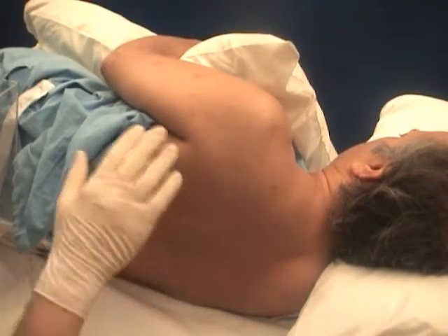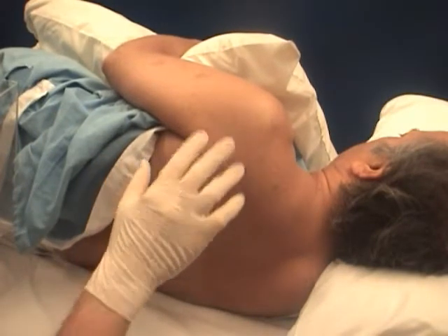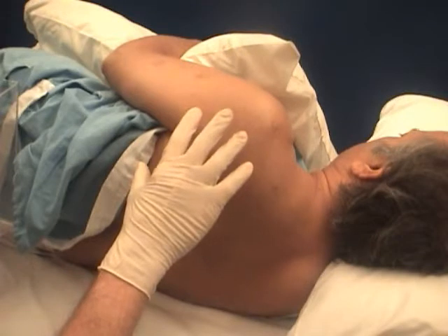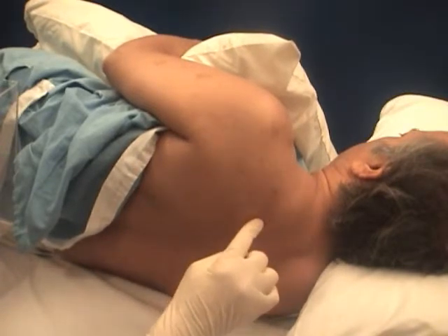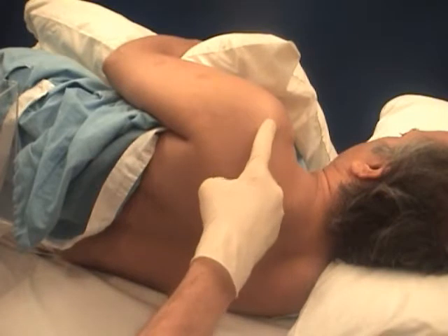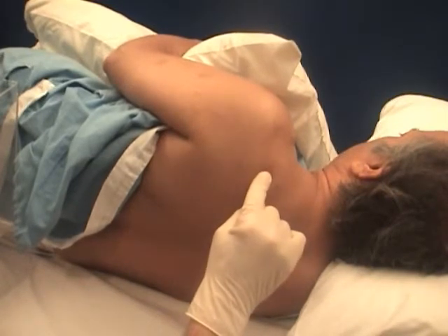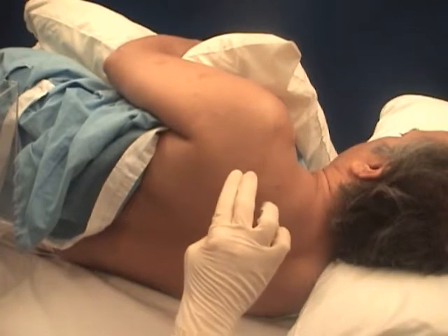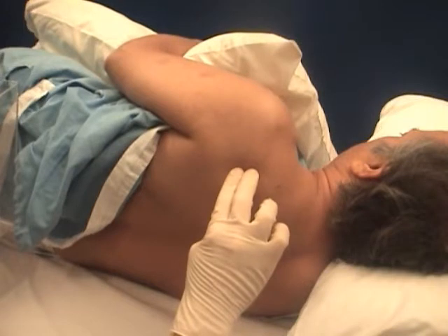Infraspinatus. The patient is in the lateral decubitus position with the side to be studied superior. The scapular spine is identified and the midpoint determined, and the needle is inserted approximately three to four centimeters, or two finger breadths, inferior to that midpoint.